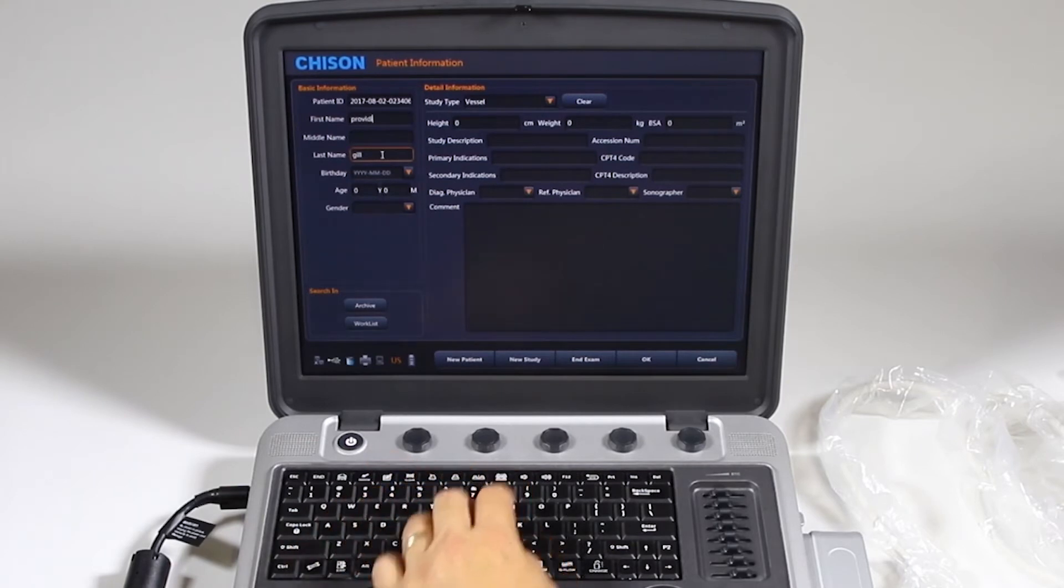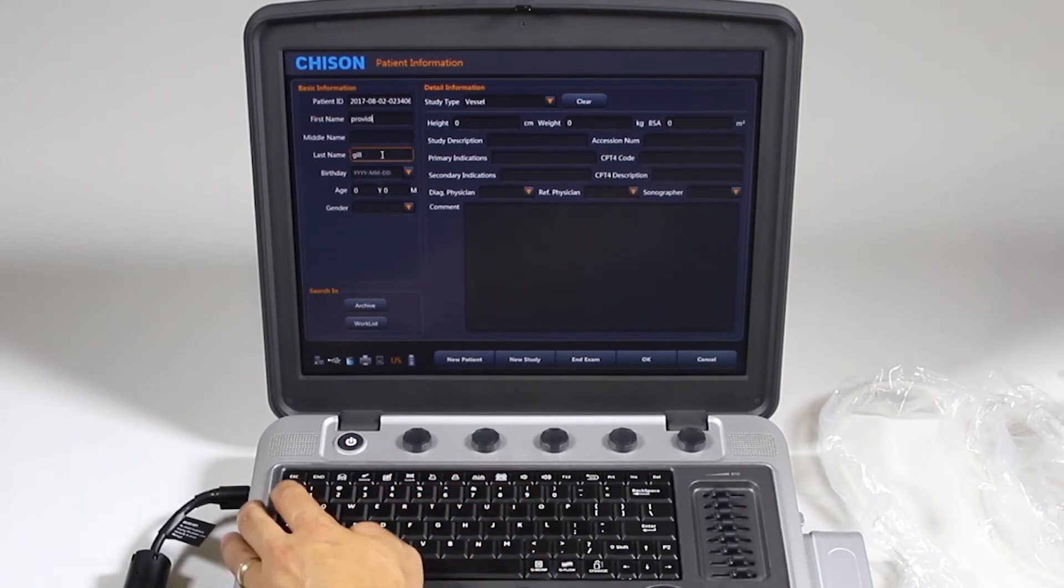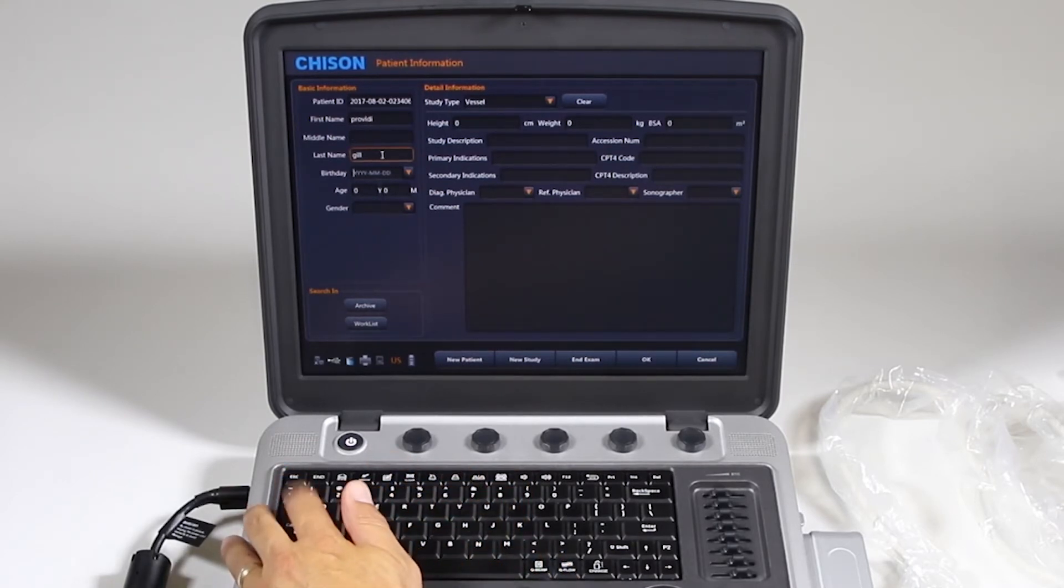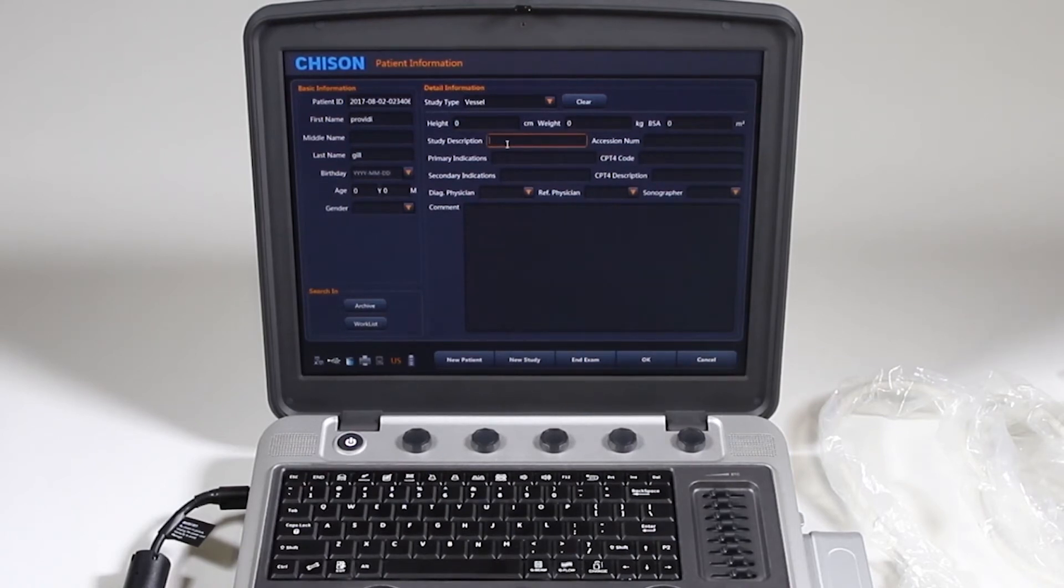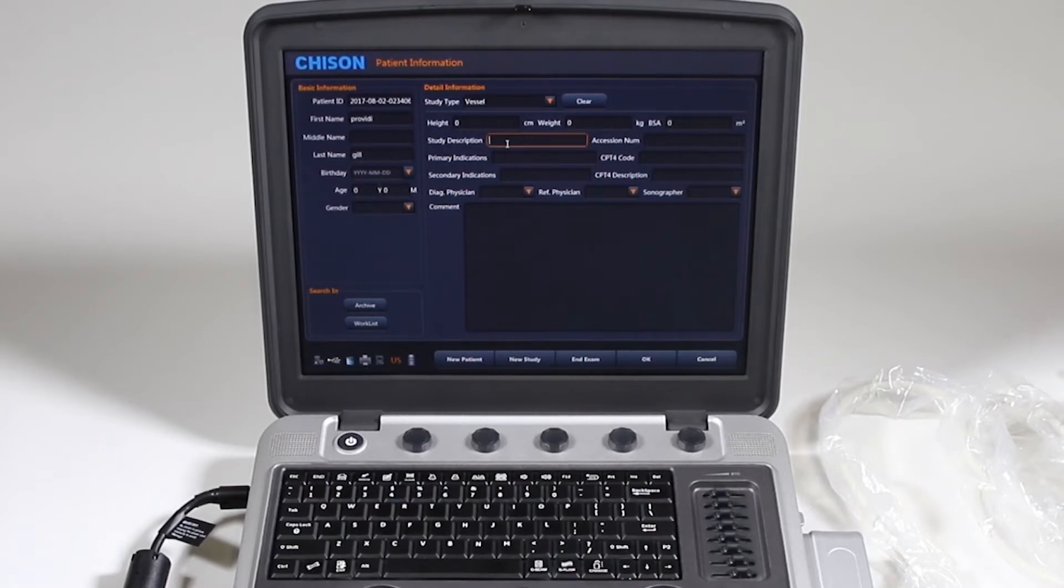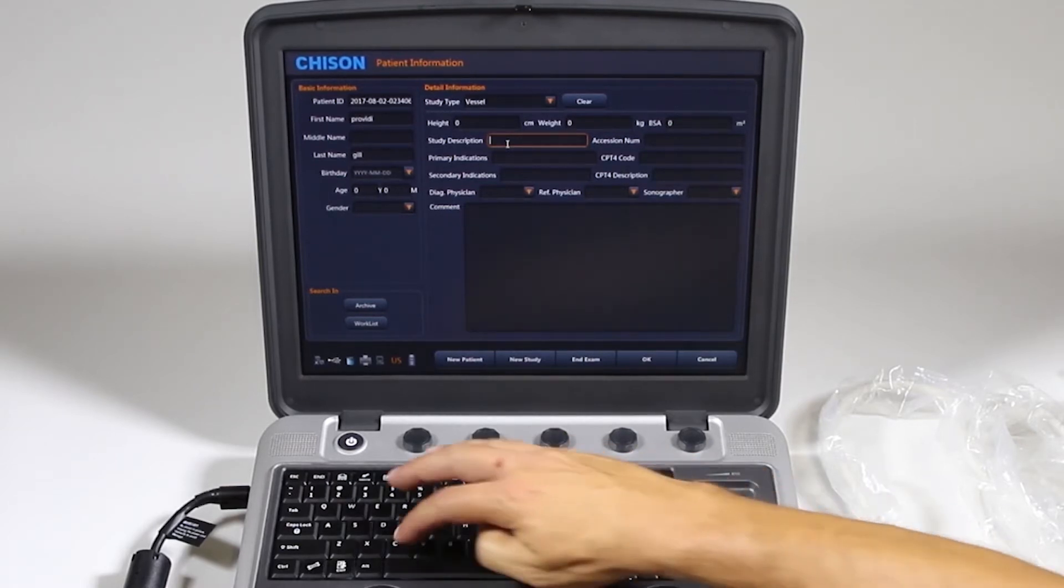I'll just put a quick name in and you can tab through these sections here. It goes to birthday, your study type, study description. If you do want something to show up on structured reports as your study type, you would type it in here.